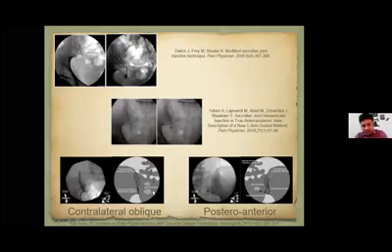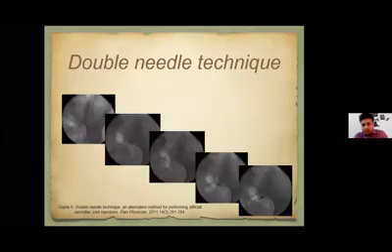In the figure down here, you can see the contralateral oblique technique. You can see a single joint with two joint lines, and here you can see four joint lines with two joints. The middle one is the posterior joint, where we do the intervention, while the lateral one is the anterior sacroiliac joint line. It has been reported that if you are not able to intervene in the medial joint line, that is the posterior one, you might go into the lateral joint line also. You can try the lateral joint line, and you might be successful with that too.